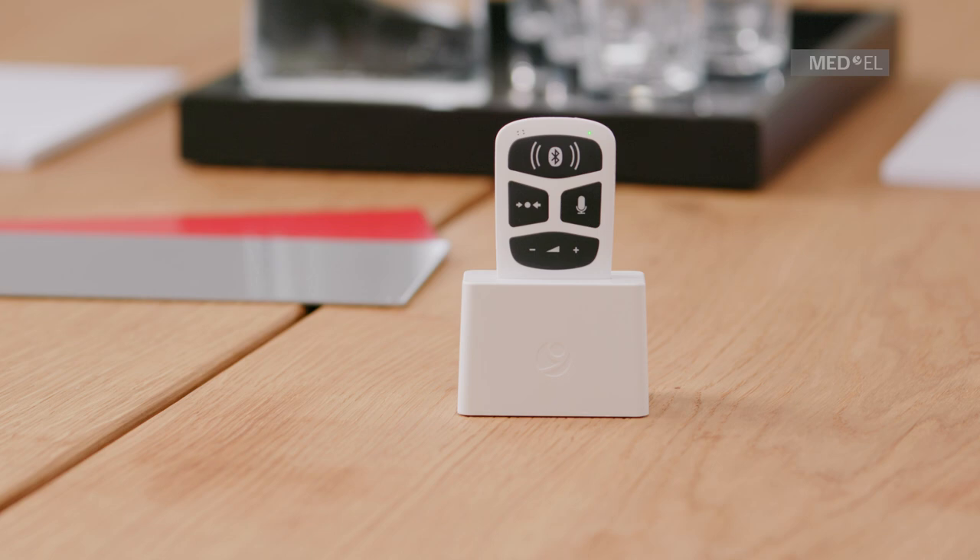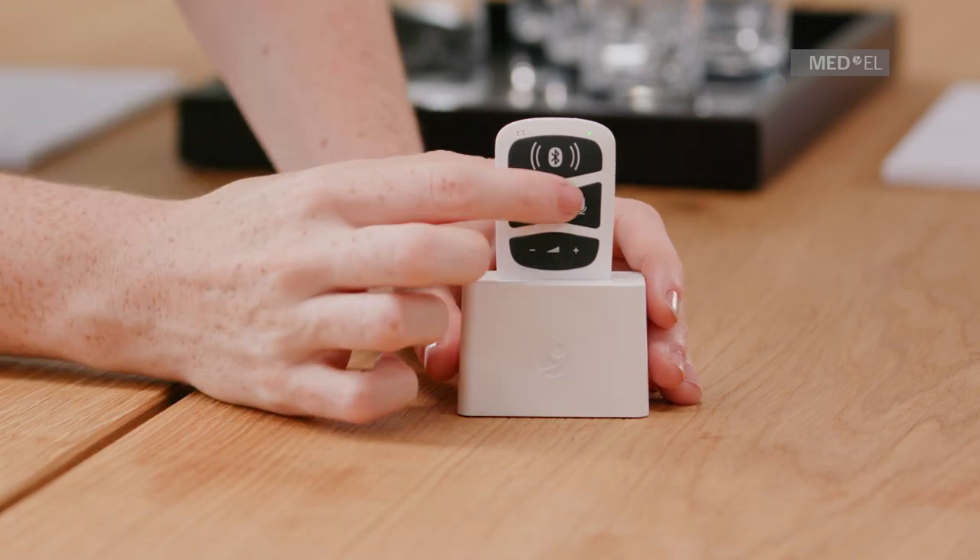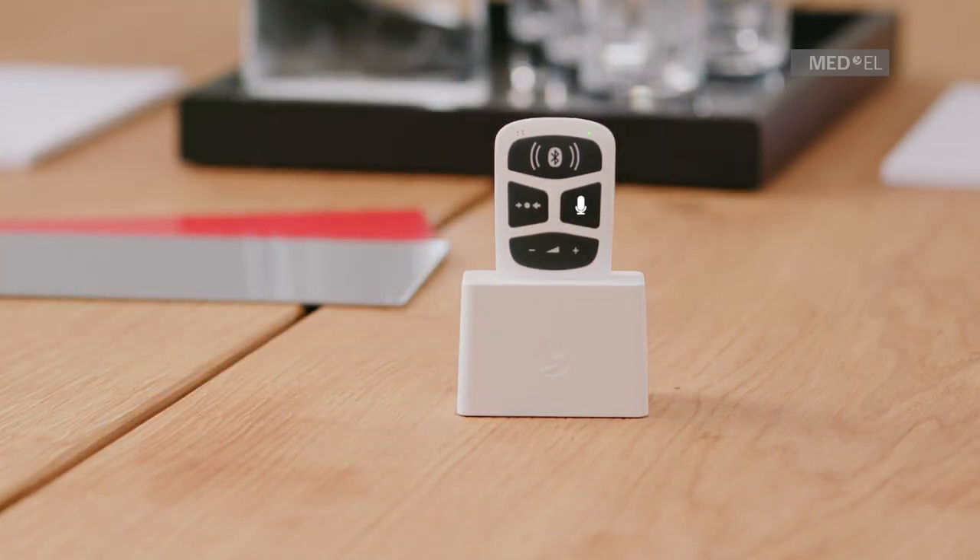First, make sure that AudioLink is paired to your audio processor. Then press the Mic button to start streaming. The Mic button will light up to show that the remote mic is activated.